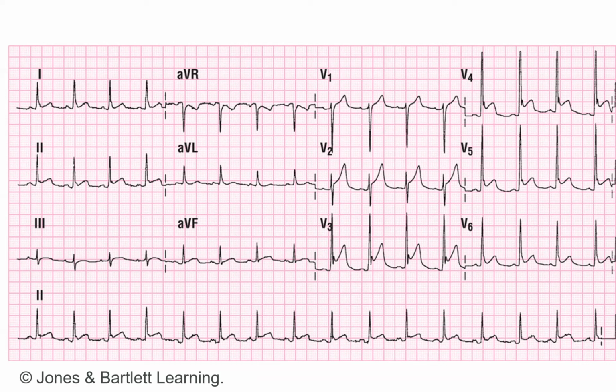II, III, aVF. Looking at II first, elevation, depression, or neutral? Elevation, we agree? Yes. One box or more? Even though we have a crappy baseline, yes, we agree. III, neutral, good. aVF isn't great, I agree, neutral. Going to V1. Box of elevation? No. V1 is neutral.